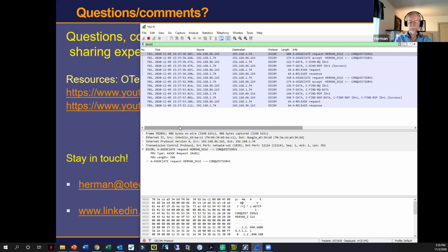If you look at the workflow, it could have the same accession number. So we have a PET and a CT, and you should really split the study. Splitting studies can be done sometimes at the modality, sometimes at the QA station. So hopefully they have 2 separate study instance UIDs that are related to those 2 different studies.